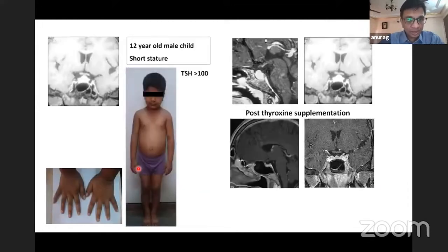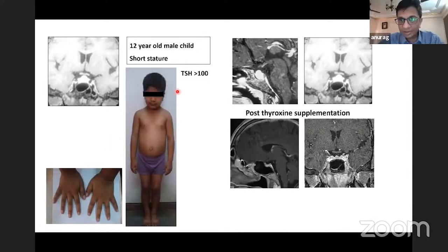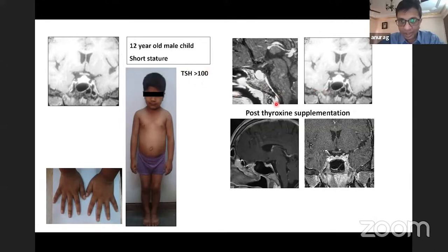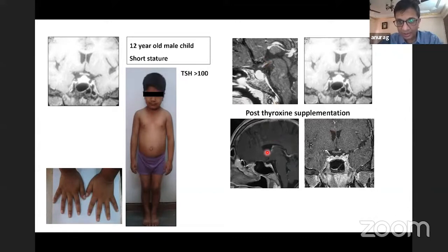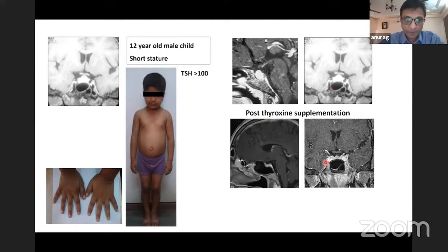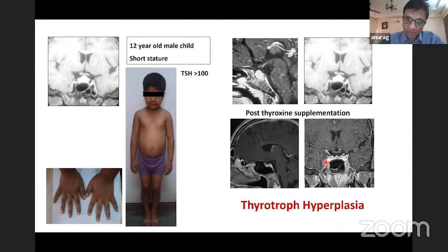This case of short stature was evaluated and an MRI showed hyperplastic pituitary. This was an obvious case of hypothyroidism with a high TSH. For academic interest, we repeated an MRI after thyroxine replacement and we can see the hyperplastic gland completely resolving over time. This is a case of thyrotroph hyperplasia.